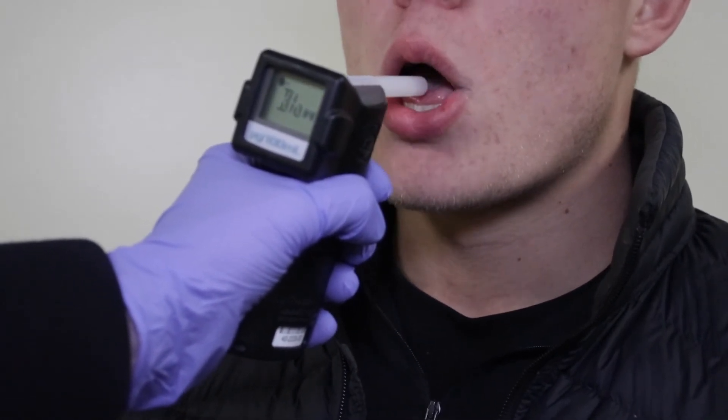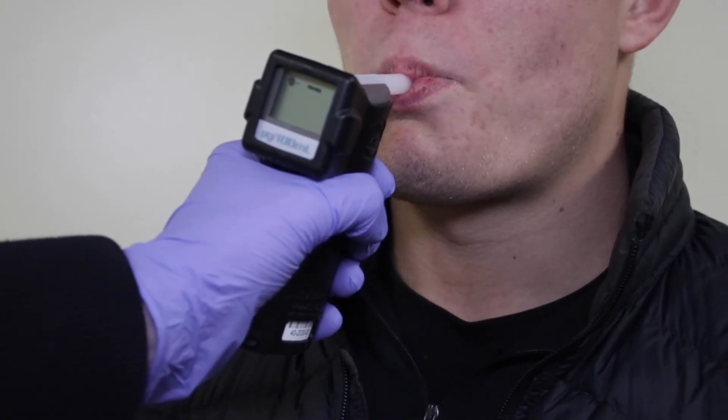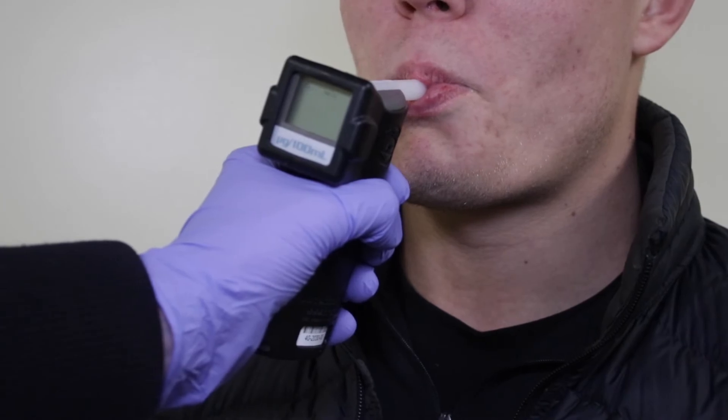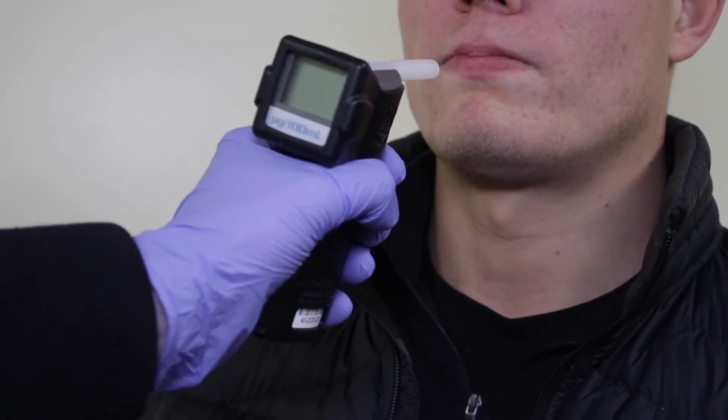Ideally ask the donor to stand, then instruct them to take a deep breath, hold it for a second, and then blow steadily into the mouthpiece for as long as they can or until you tell them to stop. You will hear a click indicating there is enough sample to run the test. The device will have a dash running across the display, signalling that it is analysing the sample.